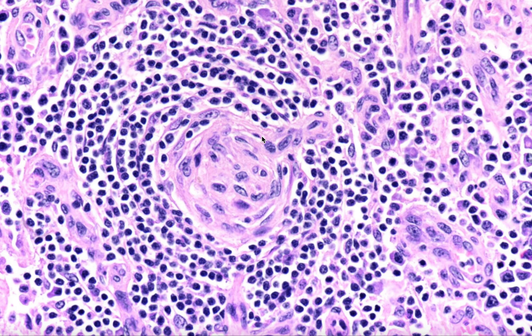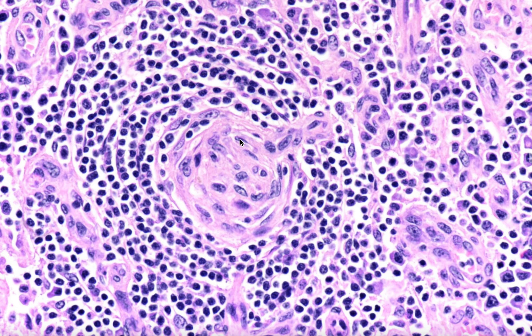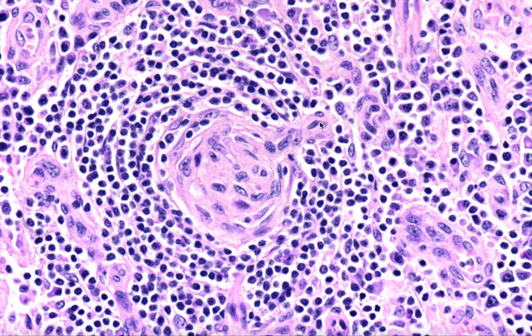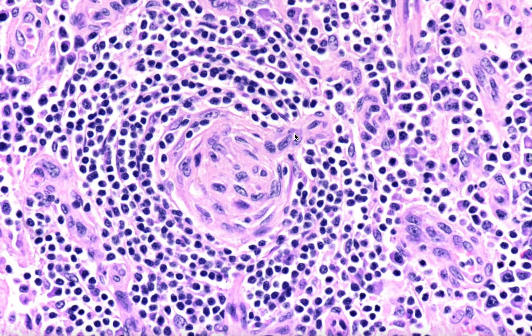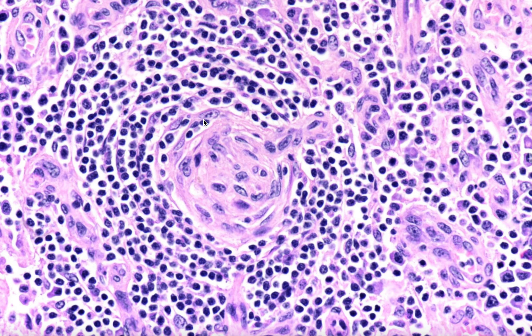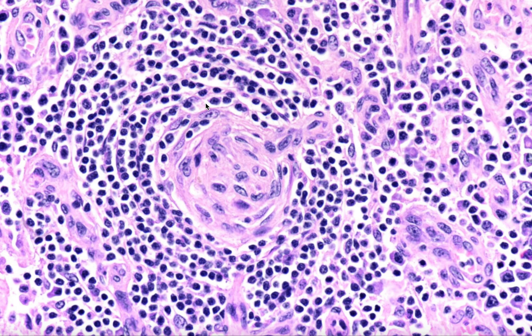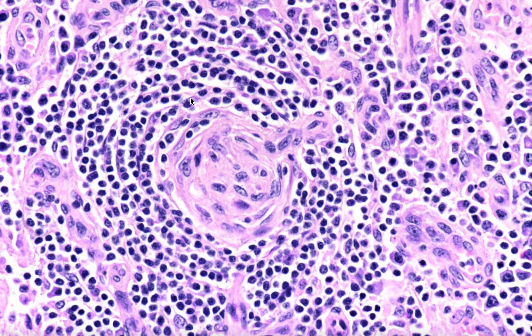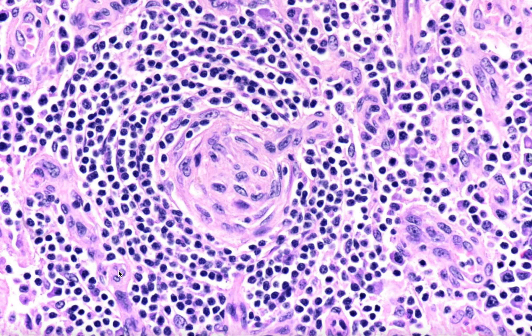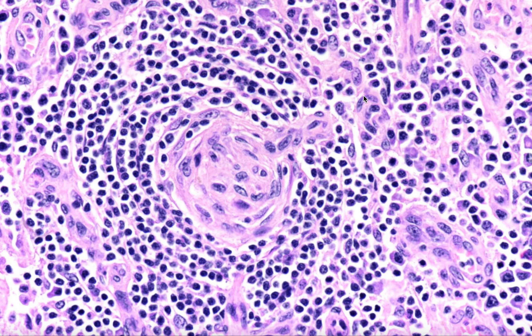You see these tiny regressed germinal centers with this vessel either penetrating or extending through, causing this handle forming what we call a tiny lollipop sign. You have small lymphocytes surrounding, forming a subtle layering called onion skinning. You have a small vessel proliferation around the germinal center.